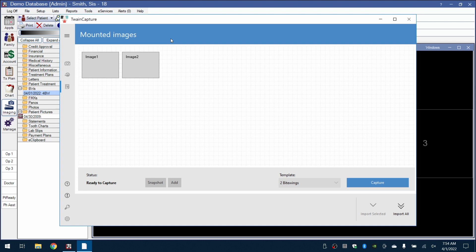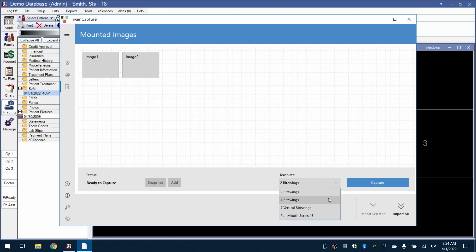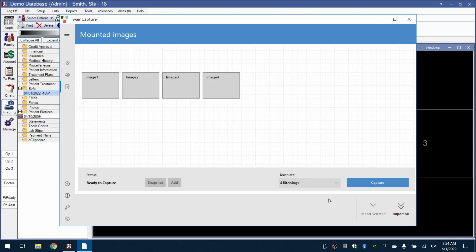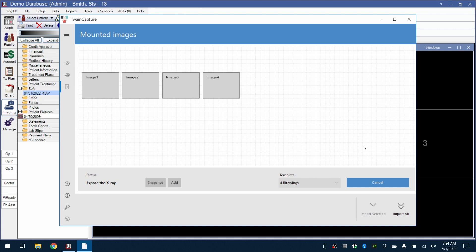We will then select the corresponding template in the blue driver window and click on the Capture button to signal to the sensor that we're ready for exposures.